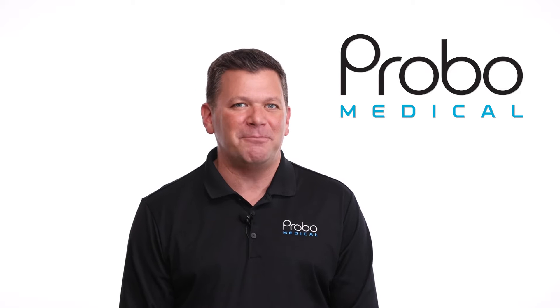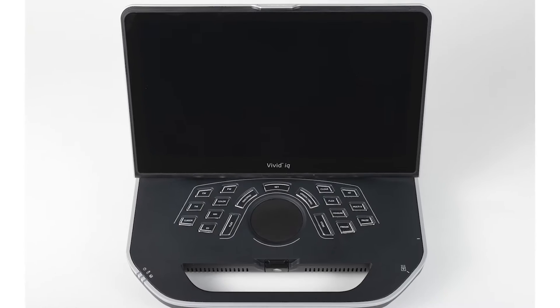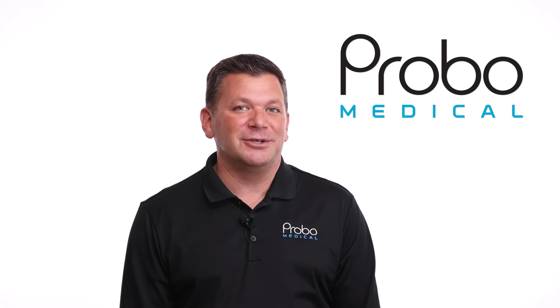At this time there are three premium portable cardiovascular ultrasound machines on the market: GE's Vivid IQ, the Philips CX50, and the Mindray M8 Elite. We love them all — so how do you choose?